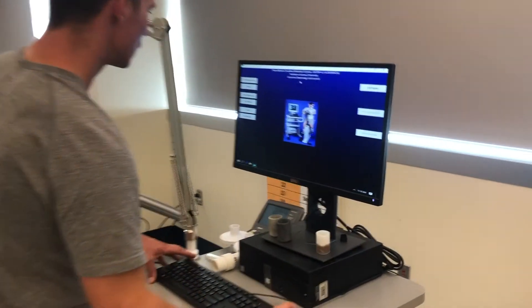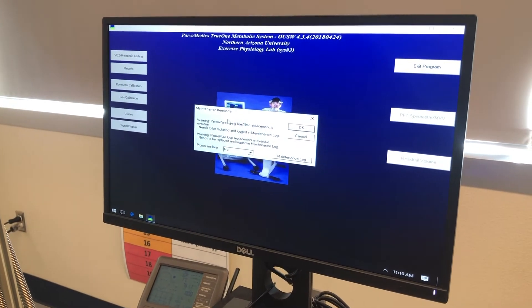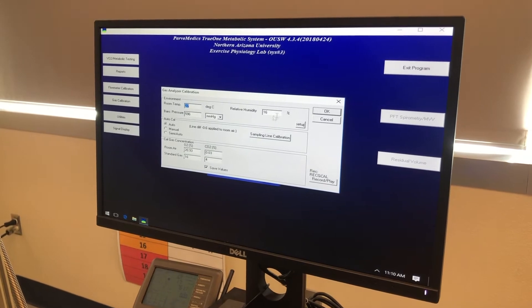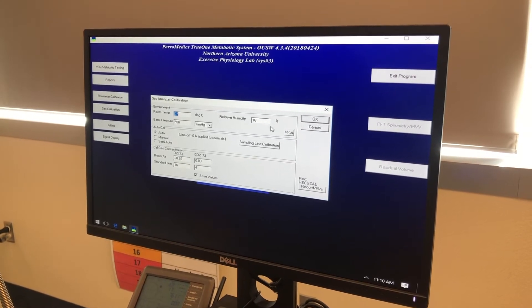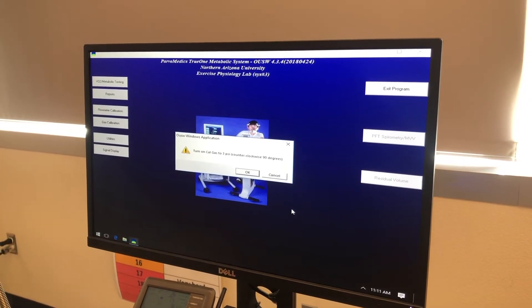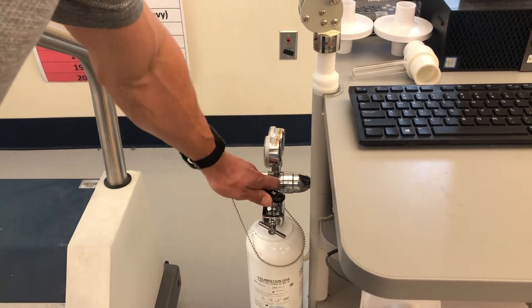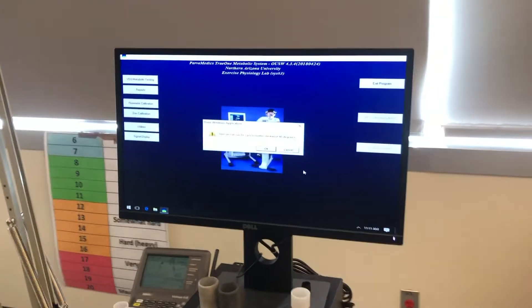We're going to click on the gas calibration tab on the left-hand side. The maintenance reminder pops up again — we'll ignore that. The room temperature, barometric pressure, and relative humidity window pops up again; it's the same as before so I'll leave it and press OK. It's now asking me to turn on the gas calibration tank to 3 PSI, counterclockwise to 90 degrees. The gas tank is over on the left — I'm going to rotate it 90 degrees to turn it on, then click OK.